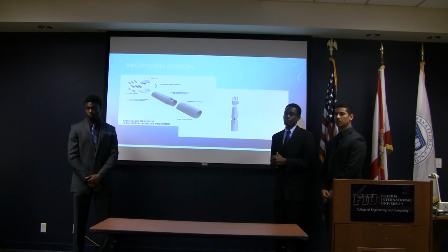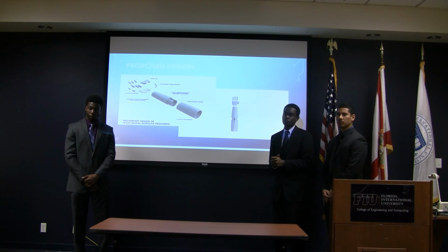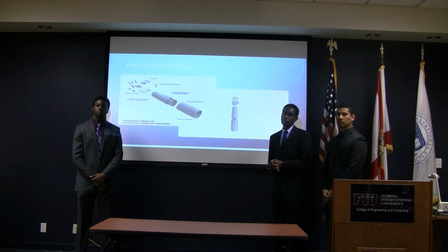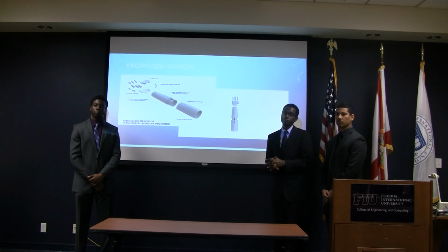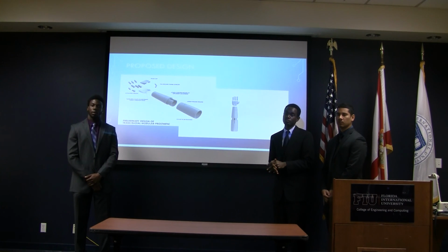Because to be able to use the prosthesis, for example by all the amputees in India, if you start putting motors and mechanisms in there, it's not going to work. And your price will go too high. To make an arm, a prosthesis that actually functions, where you can position it and hold a bottle, yet do it mechanically, would make more sense to me. And put a lot of good work into adjustability of the design. I can envision you putting a thread on that thing and having the ability to adjust it and lock it down, for example.